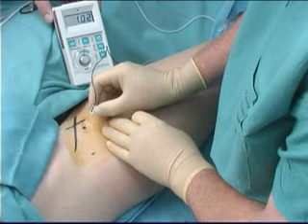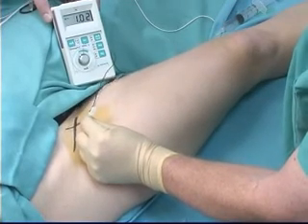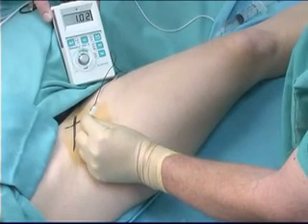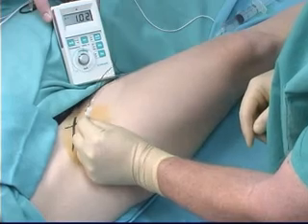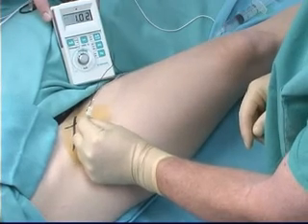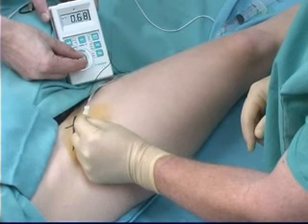The nerve stimulator is now typically set at an output of 1 to 2 milliamps, a frequency of 2 Hz, and a pulse width of 100 to 300 microseconds. The nerve to the sartorius muscle is often encountered, and this should not be confused with femoral nerve stimulation. Slight adjustment of the needle will bring it in contact with the femoral nerve with resulting clear cephalad movements of the patella due to quadriceps muscle contractions.